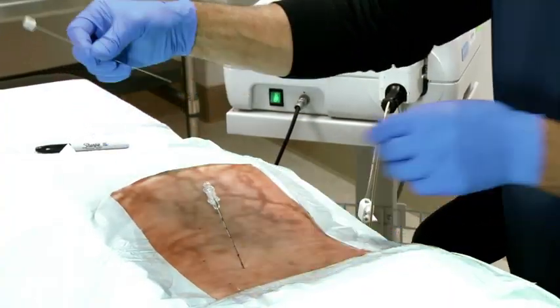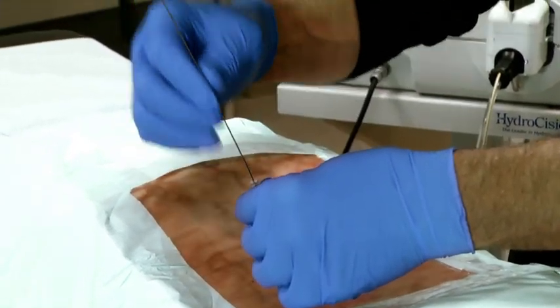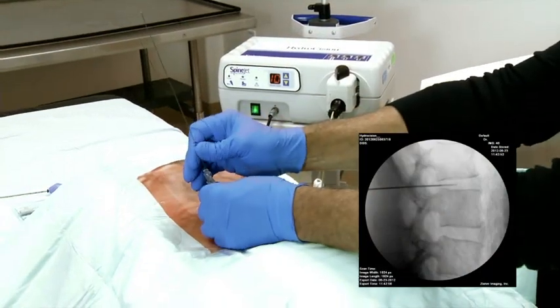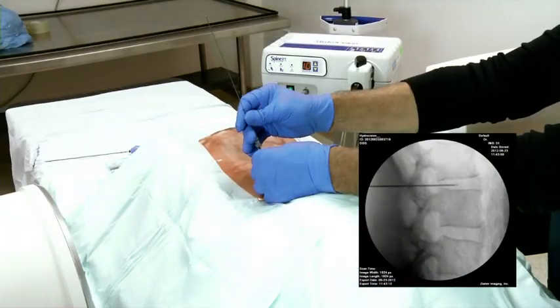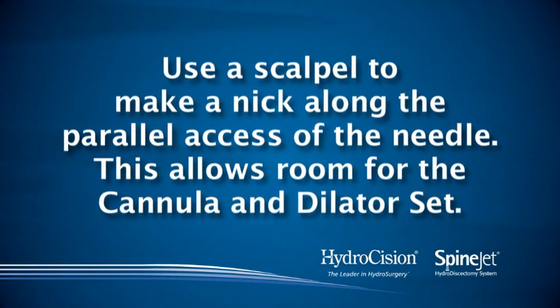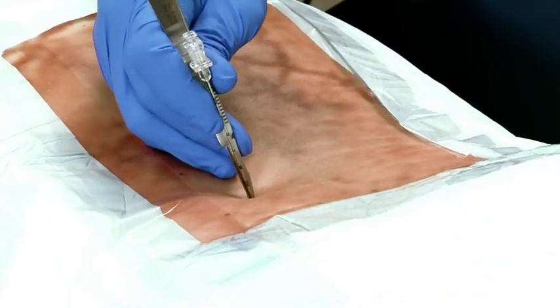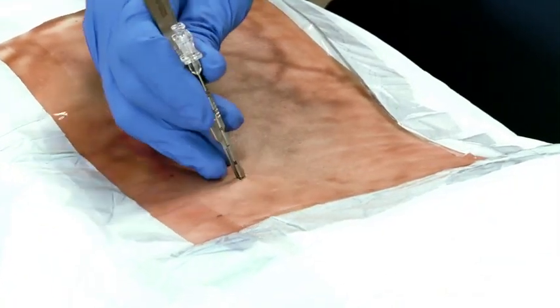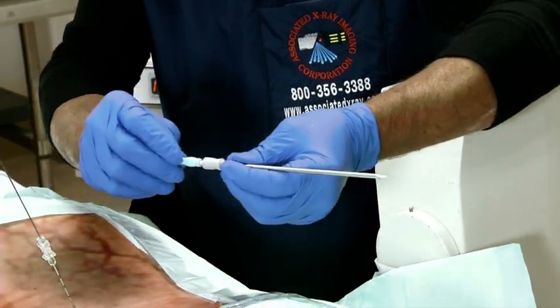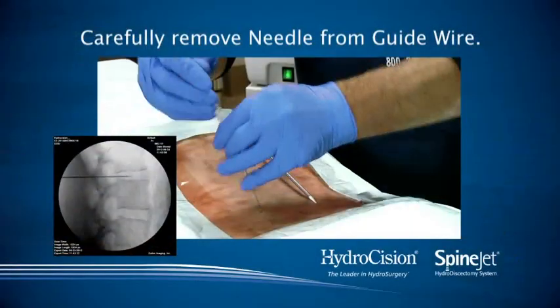Once the needle is in place, thread the guide wire using the same procedure. Use lateral, then intermittent AP and lateral views until the guide wire is in the center of the nucleus. Use a scalpel to make a nick along the parallel axis of the needle — this allows room for the cannula and dilator set. Next, thread the dilator through the cannula and lock into place by rotating the proximal blue end of the dilator clockwise one-quarter turn.